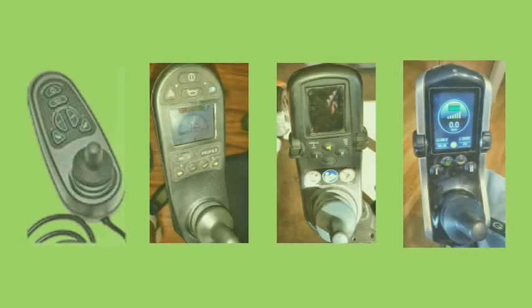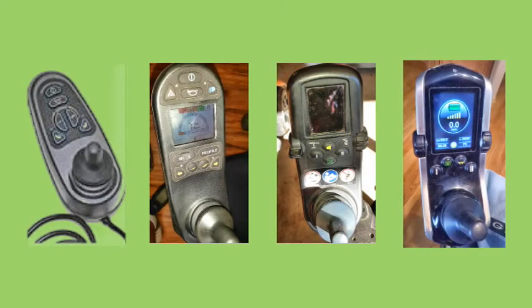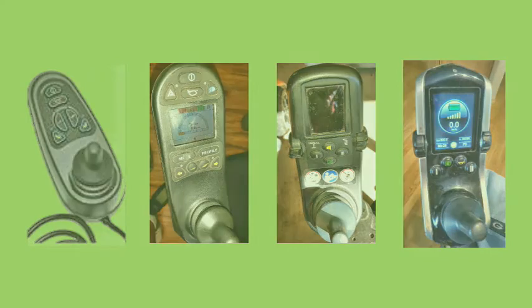Some power chair joystick assemblies are very simple to operate, while others, especially those that include the operation of several options and features, may involve a bit of patience to learn how to efficiently operate them. Some power chair systems include all of the functions in a single joystick controller, while other systems include the secondary switch panel for options like elevating seat, seat tilt, power leg rest, and others.